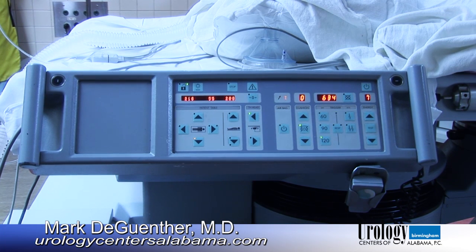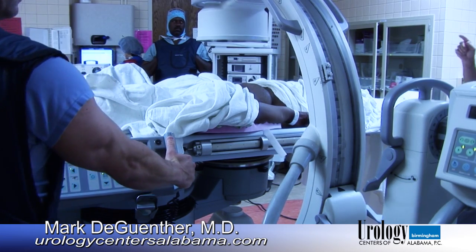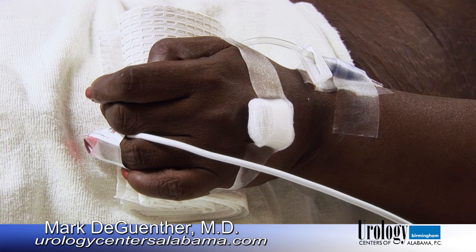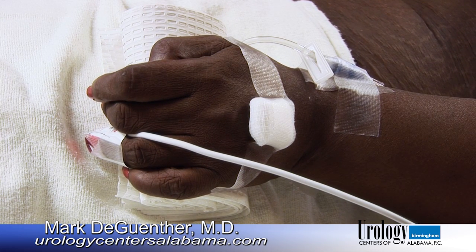These will be generated at about 120 a minute, and that's the popping that you can hear right now. This is painful for patients if they are awake, so they do need some form of anesthetic. Generally, we use a spinal anesthetic, which this patient has chosen.